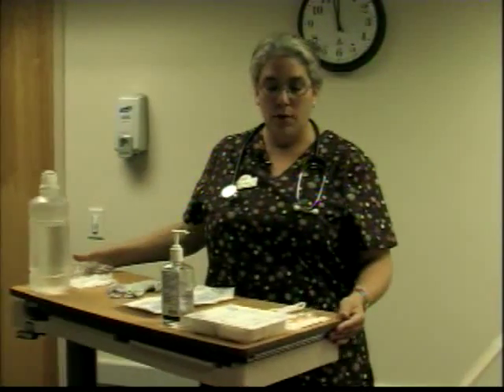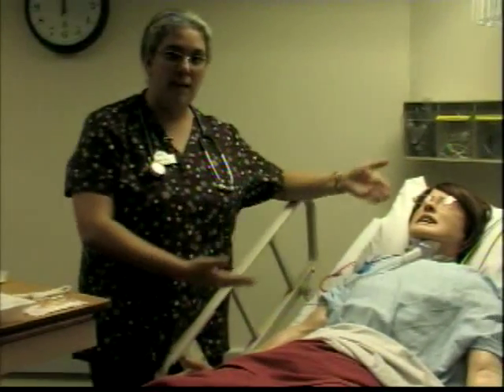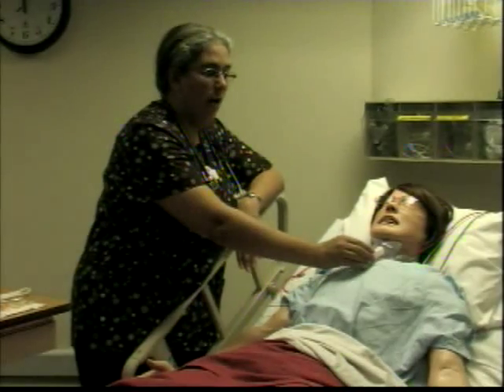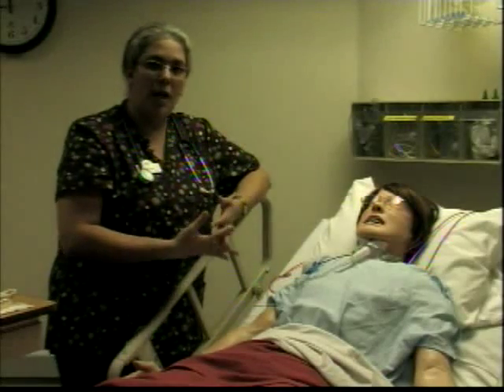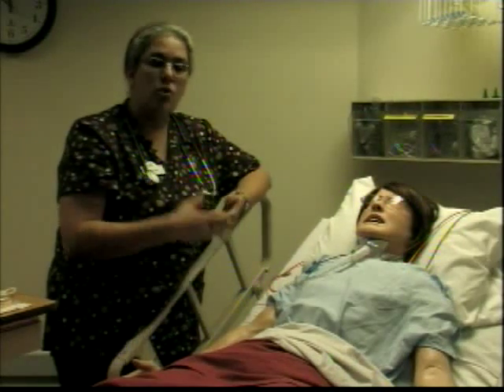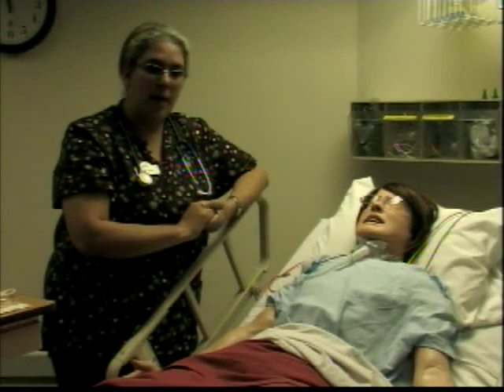Okay, so you're coming into your patient's room now, and you're going to do your assessment on your client. My client, Mrs. Shapiro, is the lady I mentioned before who had an acute stroke, and the right side is paralyzed. She has a tracheostomy, so she's connected to an oxygen source with a trach collar, and she's unable to communicate with me. Therefore, I anticipate that she's going to be anxious and a little restless throughout the procedure, so I make sure that I bring somebody with me. My CNA, Mrs. Faye, is going to be here helping me.